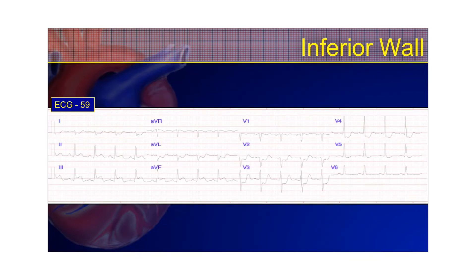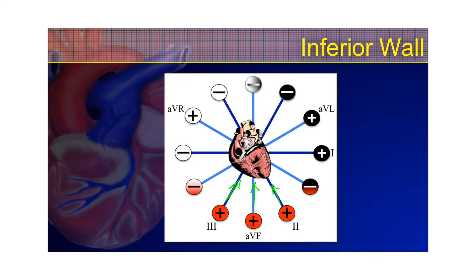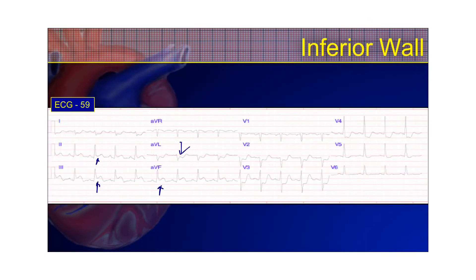Here's a typical inferior wall MI pattern. You'll see ST segment elevation — it doesn't look too impressive, but you can see it in leads 2, 3, and AVF. The second you see ST elevation in 2, 3, and AVF, look immediately at AVL. Lead 3 and AVL have their positive electrodes in nearly opposite positions, so they will show reciprocal changes for each other. If AVL has a reciprocal change, that is a STEMI — you don't need to go any further.